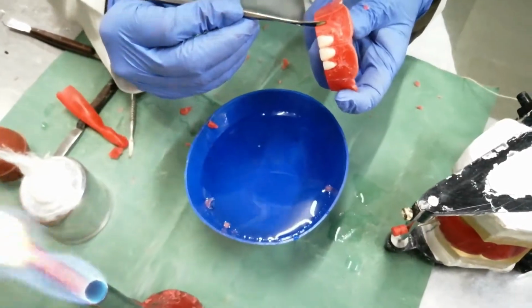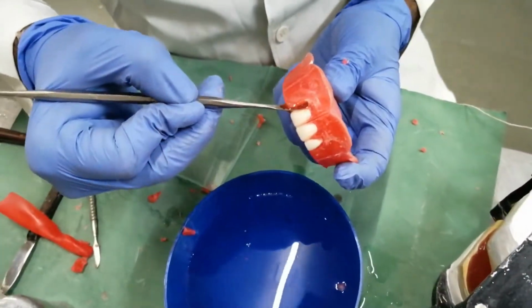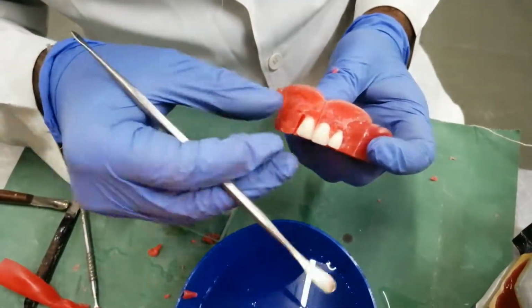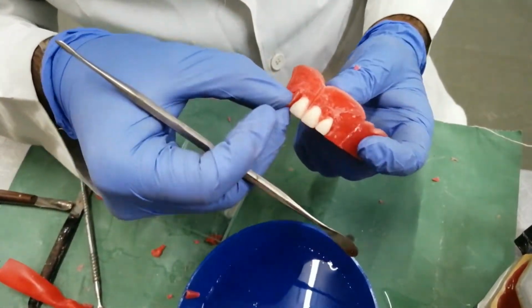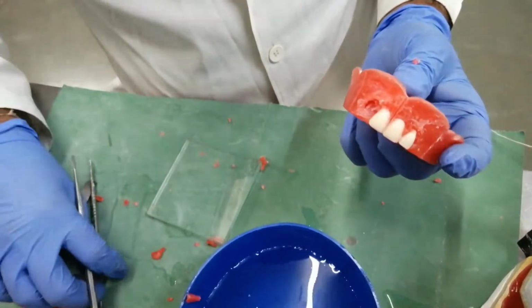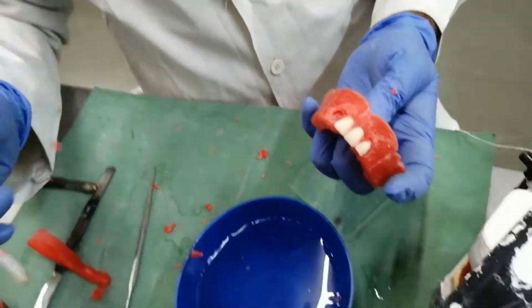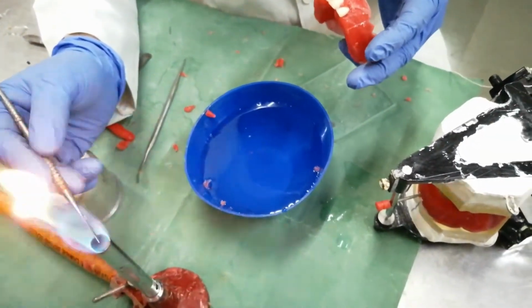Similarly, we will place another lateral incisor. Please make sure that teeth surfaces are nice and clean.